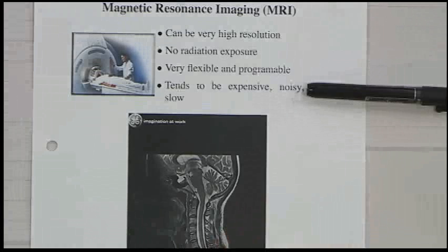An MR scan typically costs at least twice what a CT scan costs. The capital cost of the actual device is higher because you need a large superconducting magnet. And one of the reasons it's expensive is it's slow, which is another disadvantage. It's not good at capturing very high-speed images. There have been things to speed it up, and maybe people would argue that it's not really slow, but no, it's slow. It tends to be slower.